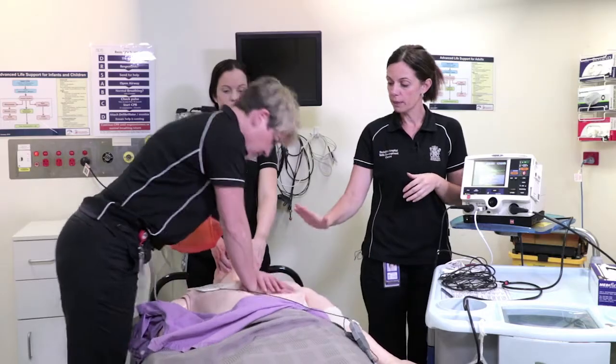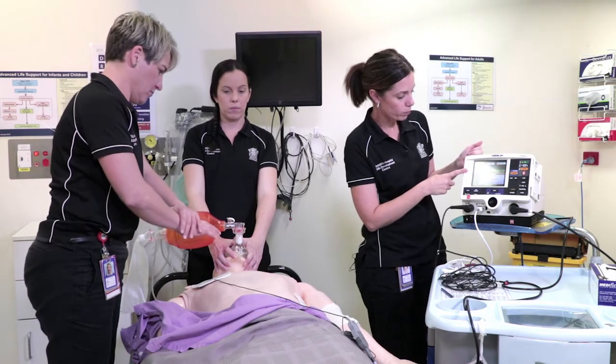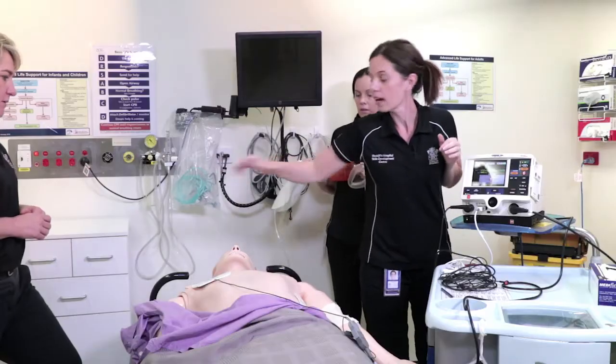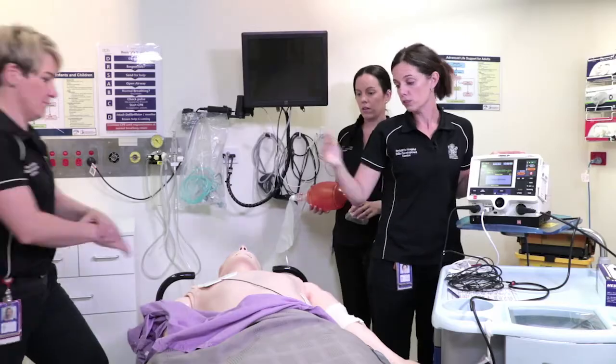Pause CPR. We're going to analyse the rhythm. We have VF — a shockable rhythm. All clear. Oxygen away. Stand clear. Shocking now. Continue CPR.